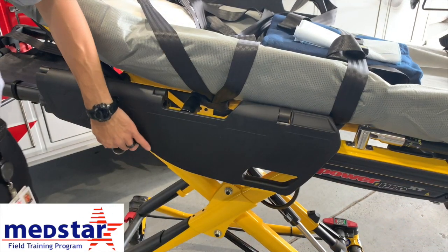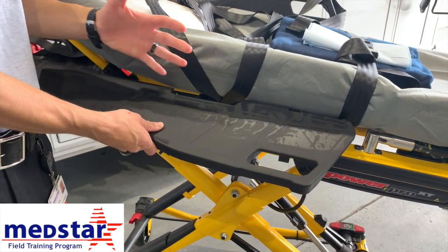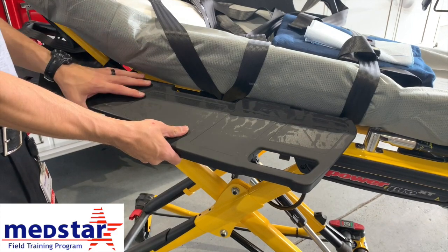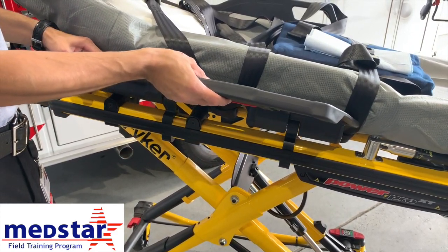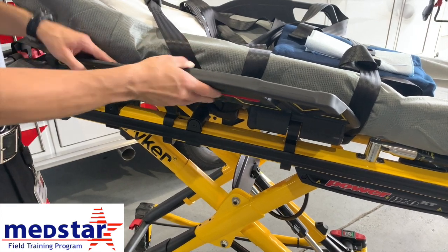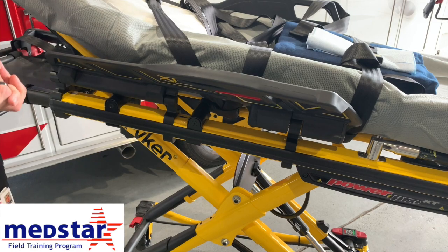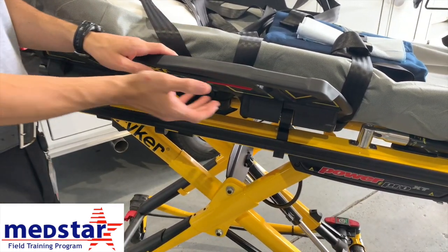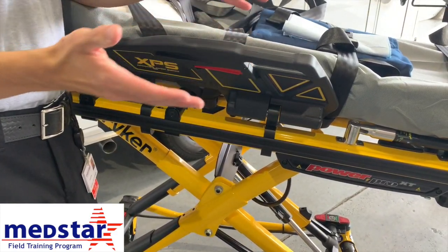With the Expandable Patient Surface (XPS) by Stryker, all of these new stretchers are now technically bariatric capable. To use the Stryker XPS system, bring the rail up until you hear the first click and make sure it's locked in place — now you technically have a bariatric stretcher. However, when a patient is on, it is important to always move the XPS system as close to the patient as possible for patient safety.